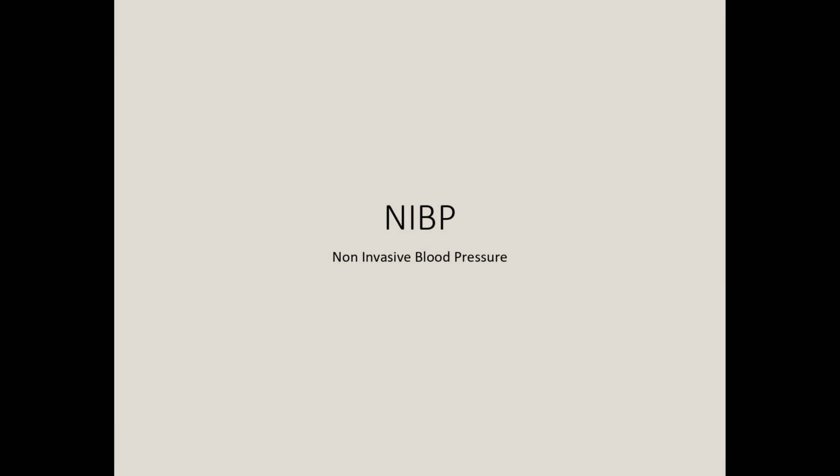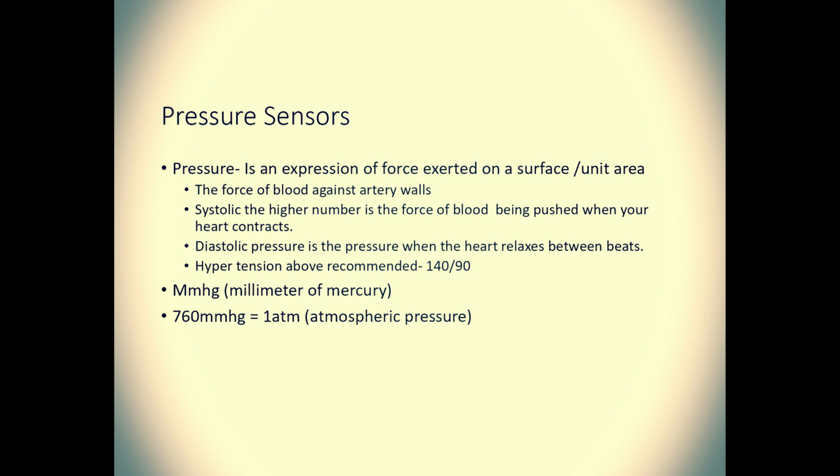Hello everyone. Today we'll be discussing NIBP, non-invasive blood pressure, and this is monitored in patient monitors inside hospitals. To start with non-invasive blood pressure monitoring, let's look into the explanation of what pressure is.